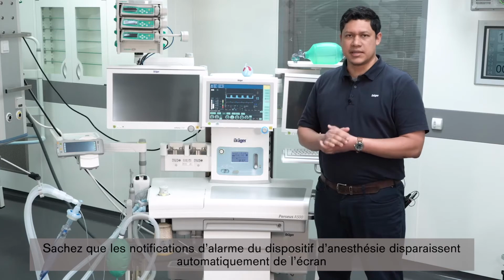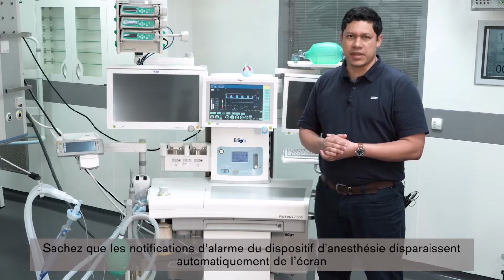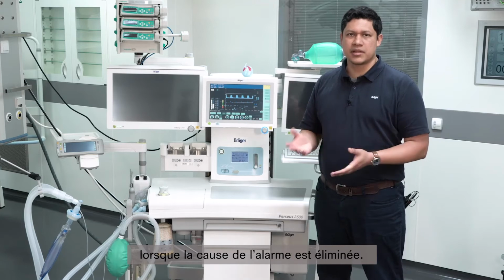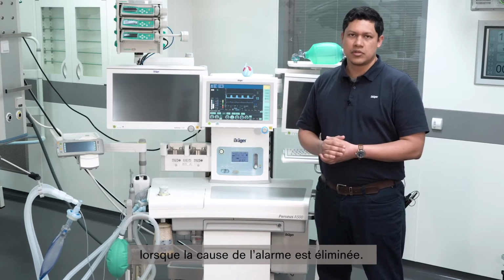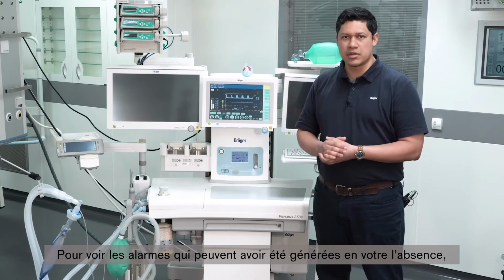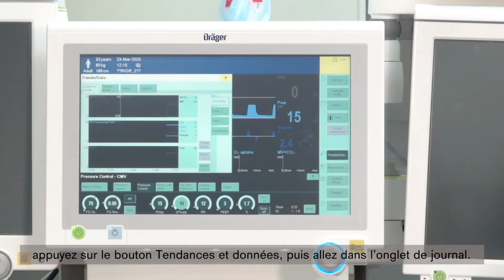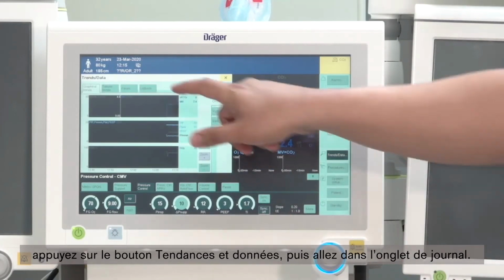Be aware that the anesthesia device will automatically delete the alarm messages on the display once the event triggering the alarm has disappeared. To verify on the alarms that might have occurred in the absence of the user, first go to the Trends and Data button, and then go to the Logbook tab.